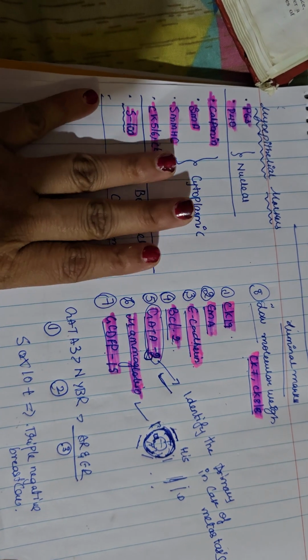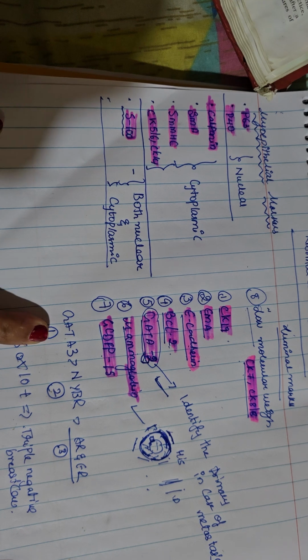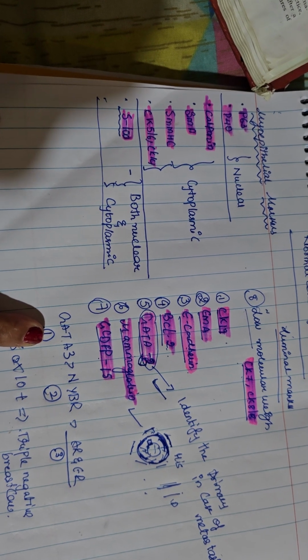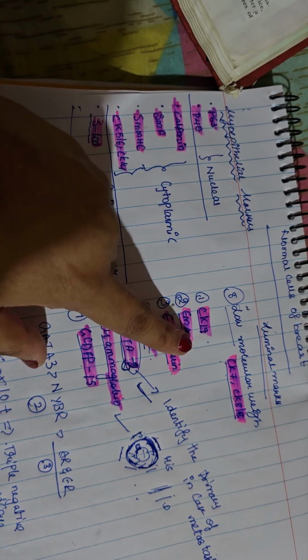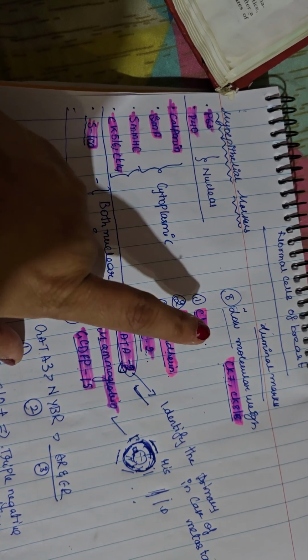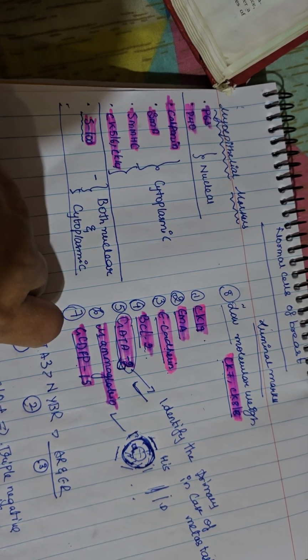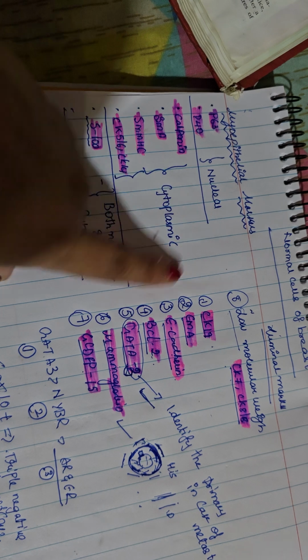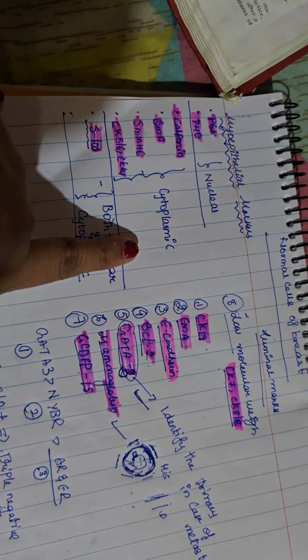Very important is GATA3, because it is useful to identify the primary in case of metastasis, because it helps to identify that these are breast luminal cells which are proliferating due to metastasis. So these luminal markers are very useful in identification of the primary, whereas myoepithelial markers are helpful because they are always absent in invasive cancer of the breast.